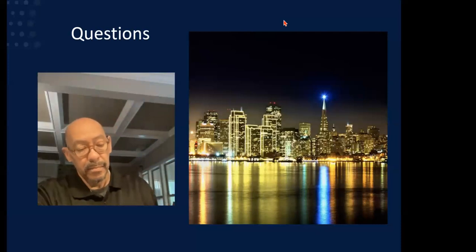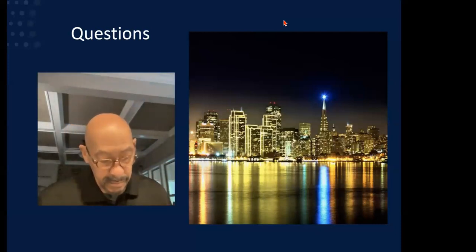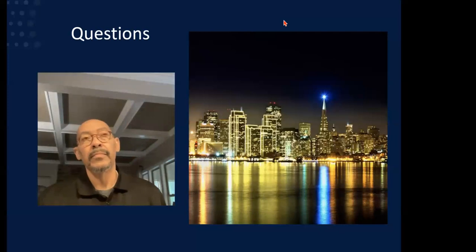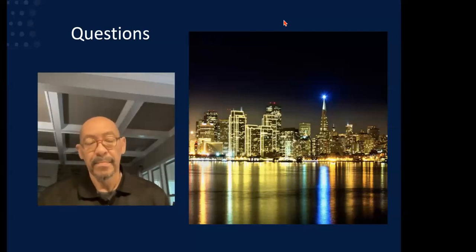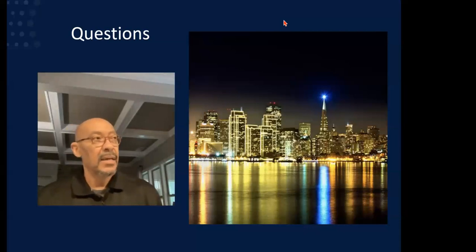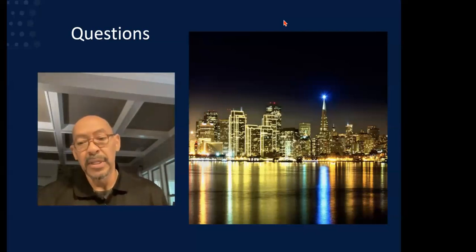I have glaucoma and had understood the Ocumetics lens may have positive benefits or may negate or help with glaucoma. Is this true? Also, I'm nearsighted and had LASIK years ago, but now I'm wearing glasses again. Will the surgery be an issue for me? So I'll deal with the back part of that before the front part. Just because you had LASIK, it doesn't exclude you from being a potential candidate for this lens.